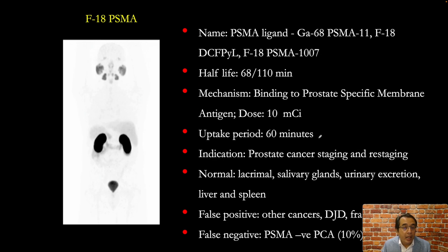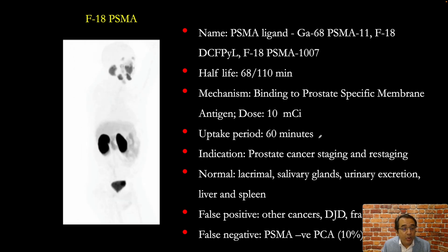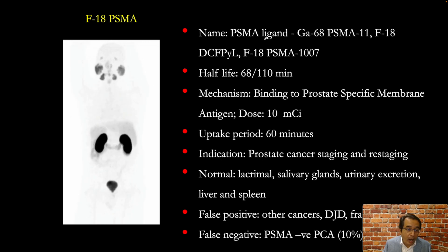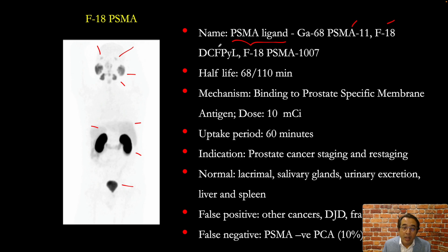The next PET scan we are going to review is F18 PSMA — it can also be performed using gallium-68. Here is a normal distribution of the tracer showing characteristic uptake in the lacrimal glands bilaterally, followed by the salivary glands, faint uptake in the liver and spleen, and excretion from the kidneys into the bladder. PSMA ligand options include gallium-68 PSMA-11, F18 DCFPyL, and F18 PSMA-1007. The half-life of gallium-68 is 68 minutes; the half-life of F18 is 110 minutes.